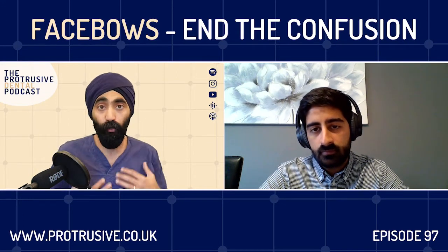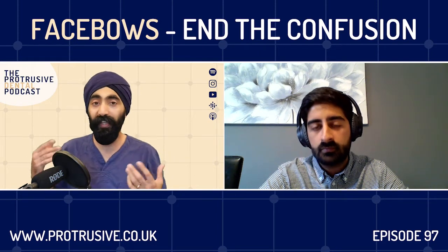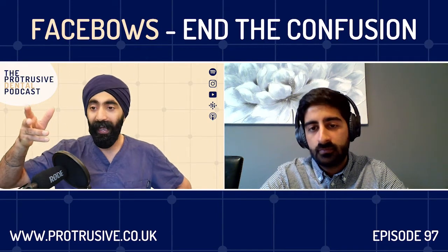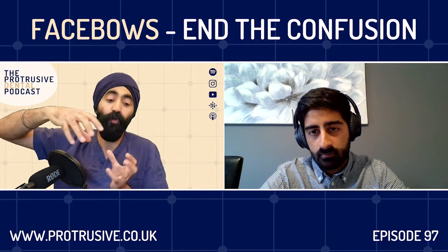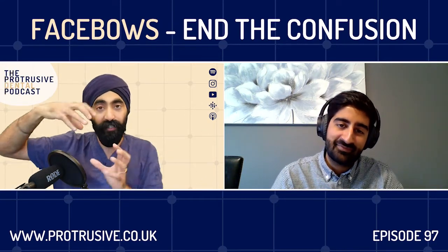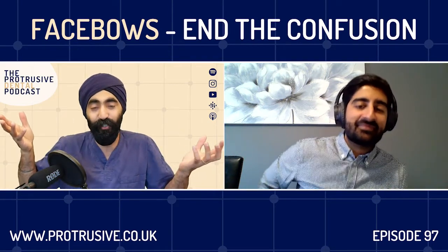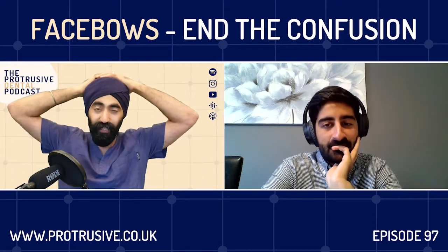But as someone who uses articulators or Facebows very, very little nowadays, and goes more digital, the thing that really annoyed me the other day, Salman, was seeing some of these virtual articulators. I didn't understand the following: on the actual articulators, for example, it's the upper member that's moving, but we're sort of visualizing it as the lower moving. But even on the virtual articulator, they still designed it so the upper moves. I'm like, well, why would you do that? Just make the lower move. Why would you design it that way, even on a virtual articulator, when you have the power virtually to change all that? So that was like, what the hell is this?